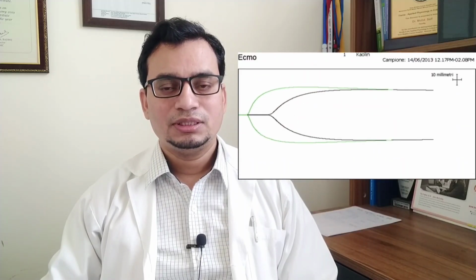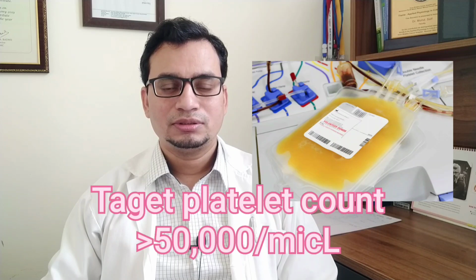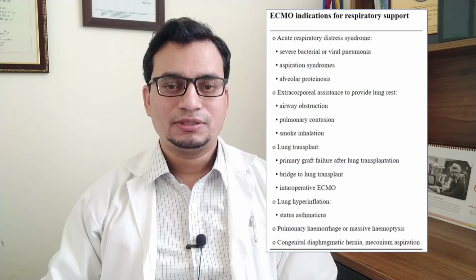Thromboelastography is a useful adjunctive device which can be used to titrate the anticoagulation, and also the platelets, which are continuously consumed during ECMO, require monitoring, and they should be kept at least more than 50,000 per microliter, and hence require platelet transfusion. The main indications of ECMO are severe refractory ARDS, COPD exacerbations, and as a bridge to lung transplantation.